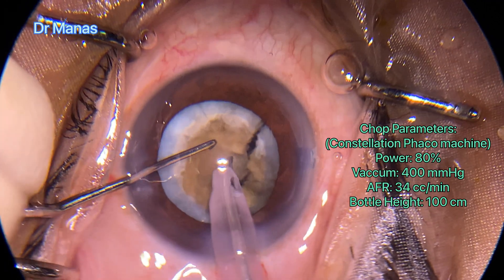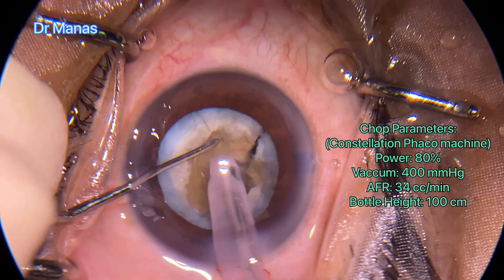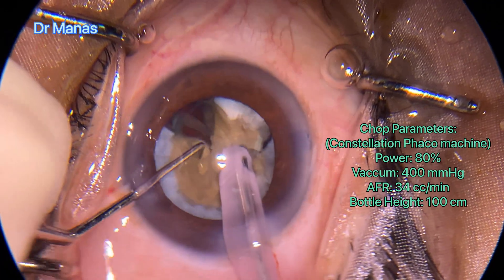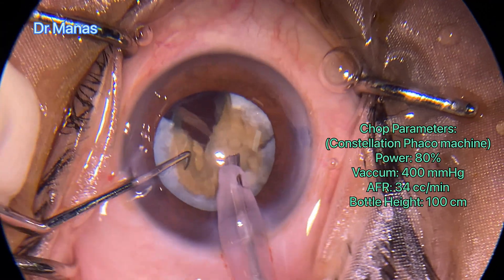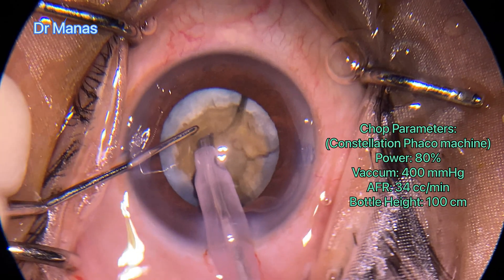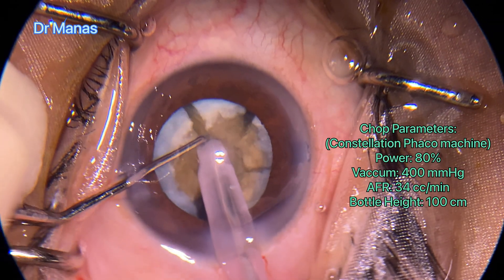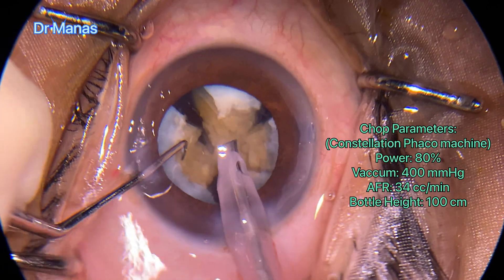Now that the back has been debulked a little bit, it's easier to rotate the nucleus. With step-by-step lateral separation, the posterior plate has also been cracked. Gentle rotation of the nucleus, going again deeper inside to separate the posterior plate.